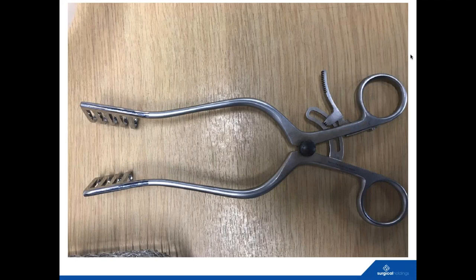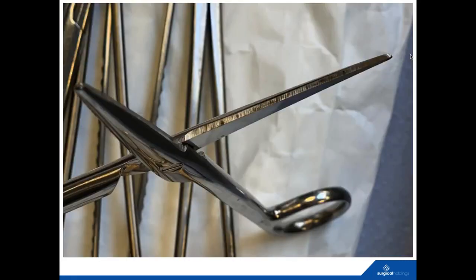Here we're talking about composition of stainless steel. You can see straight away that the nut that's used there to hold it together is made from a different steel, because that's gone a slight black color. So we would suspect that that's probably mild steel, and somehow a mild steel piece has got into the manufacture process, or when it's been repaired, that's been put in. But that's what will happen if you don't have steel that has the right chemistry, the correct composition, to maintain passivation. And of course, scissors as well, very visual.